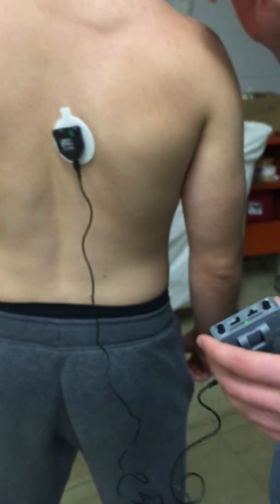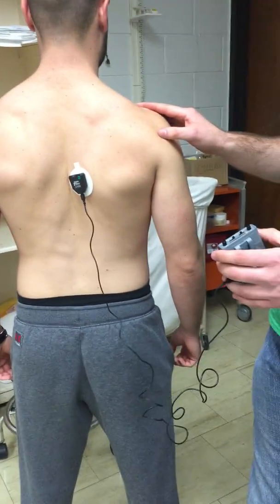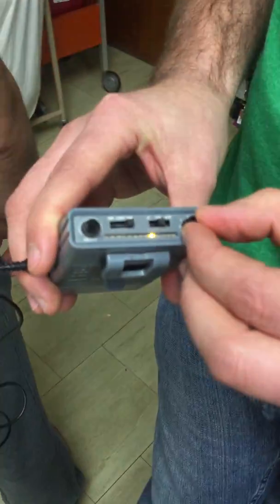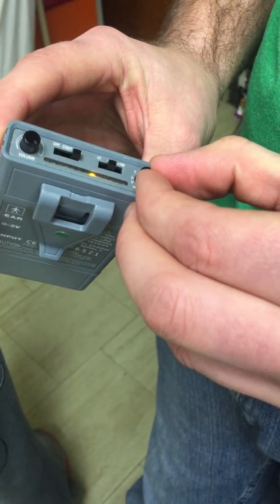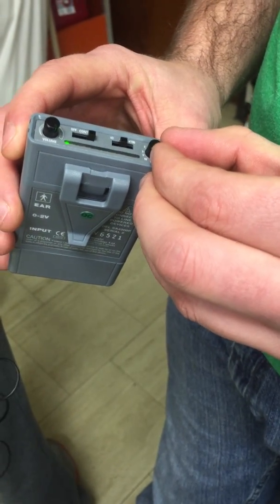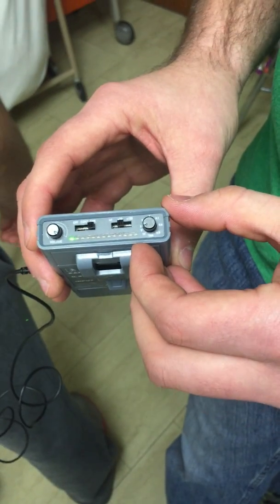We're going to have Matt hold his shoulders down and kind of back. You can already see that it's activating the device here, so we can turn that up to get that lower. Now we'll actually have him raise his arm forward to 90 degrees. Right there, we're getting pretty much right to the max with a 3 out of 10, so we're at about 60 for the max there. Go ahead and do that one more time.